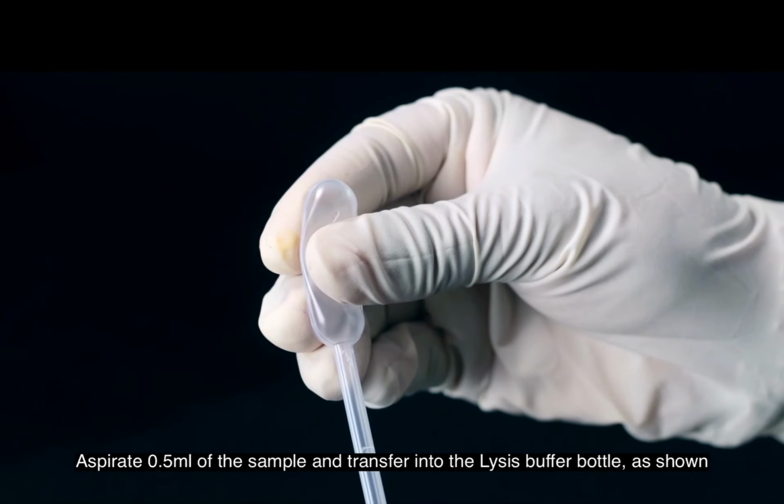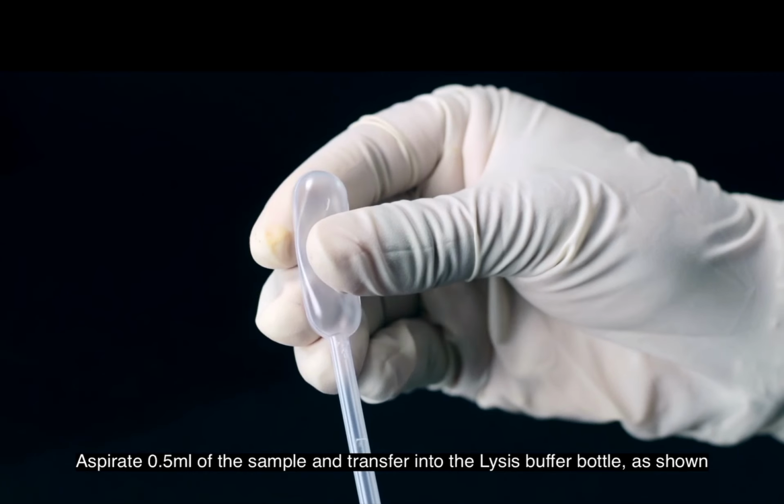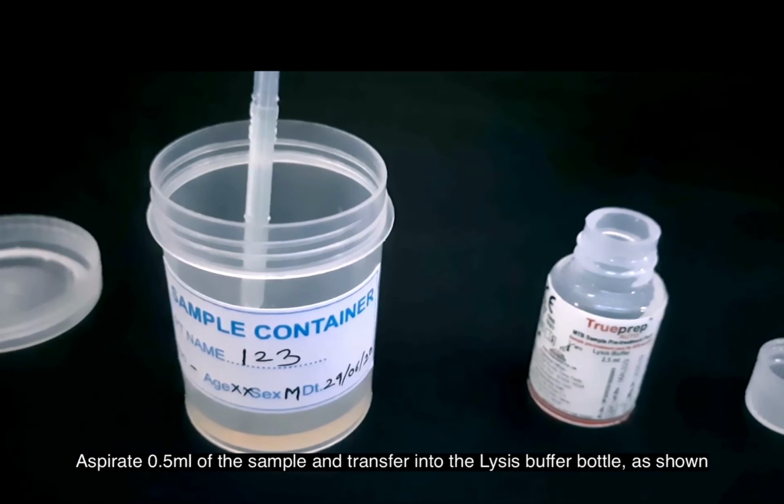Then when you release, you have to release slowly. Please never release the plunger very fast, whether it is this particular pasteur pipette or even your micro precision pipette. Release slowly, then fill it up to that 0.5 ml mark. This is why you have to keep the lysis buffer ready, with the rubber cork removed and thrown away. You cannot hold the pipette in one hand and then start opening the lysis buffer. So all this has to be kept ready. So you have taken 0.5 ml.